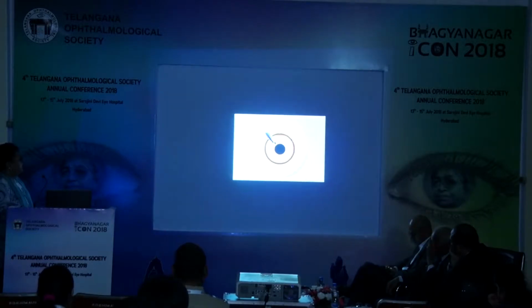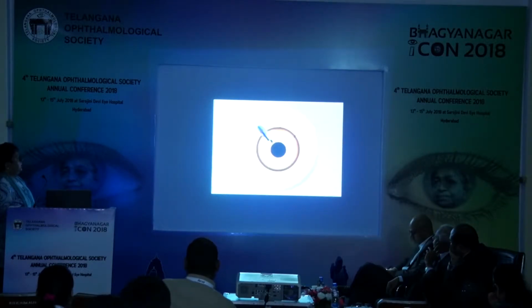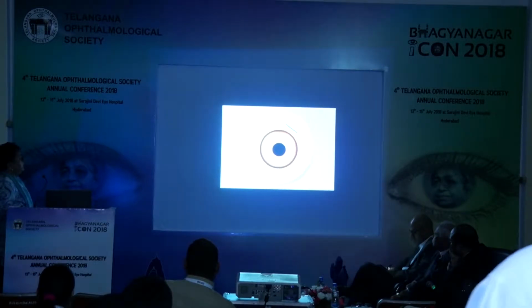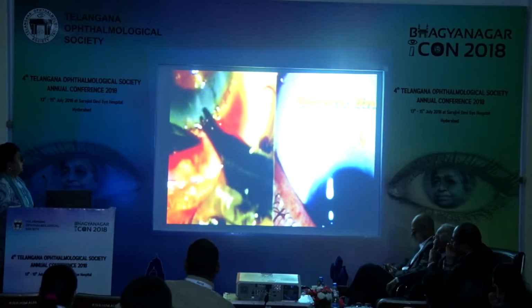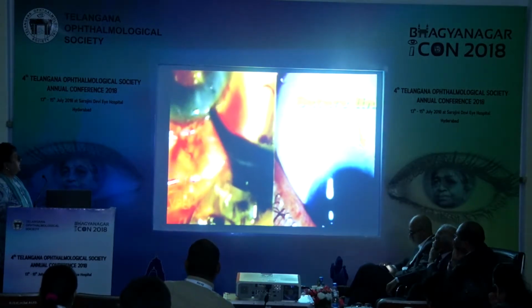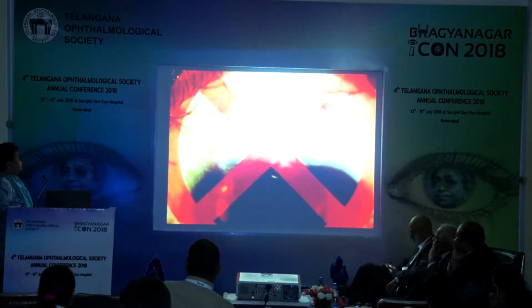In twin-site surgery, separation of phaco and filter helps to minimize tissue handling and subsequent decreased inflammation and fibrosis. Filtration wound 1.5 mm away from the limbus, and our type of conjunctival closure avoids astigmatism. It also spares limbal stem cells, preventing conjunctivalization of the cornea and overhanging dysesthetic blebs.